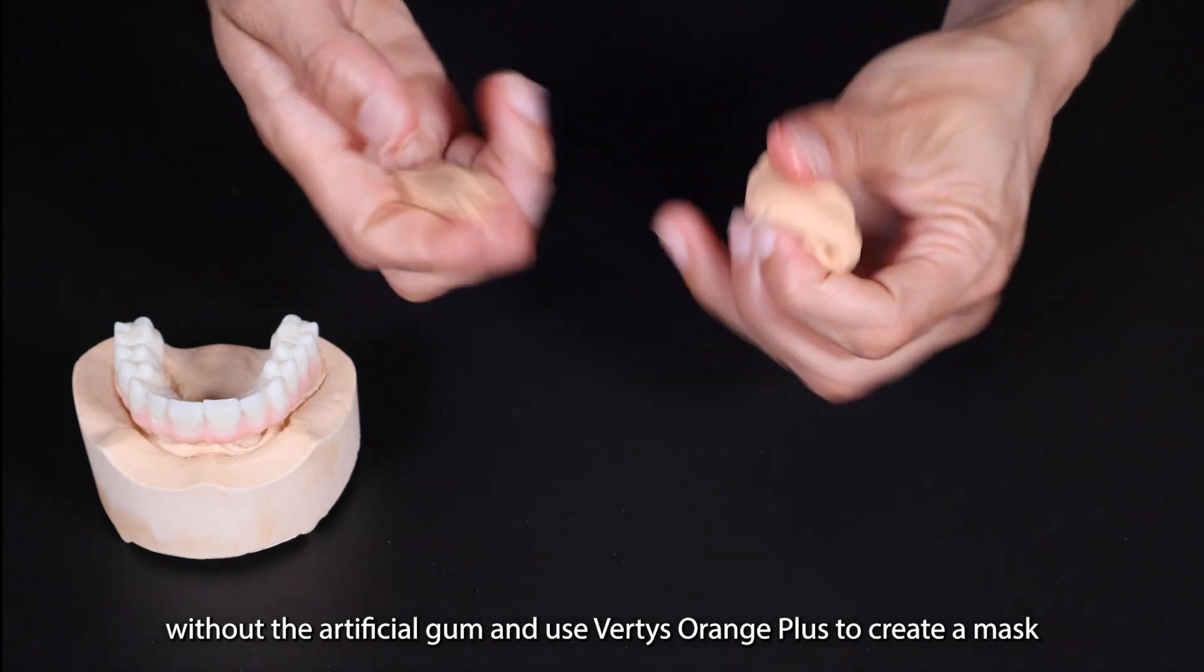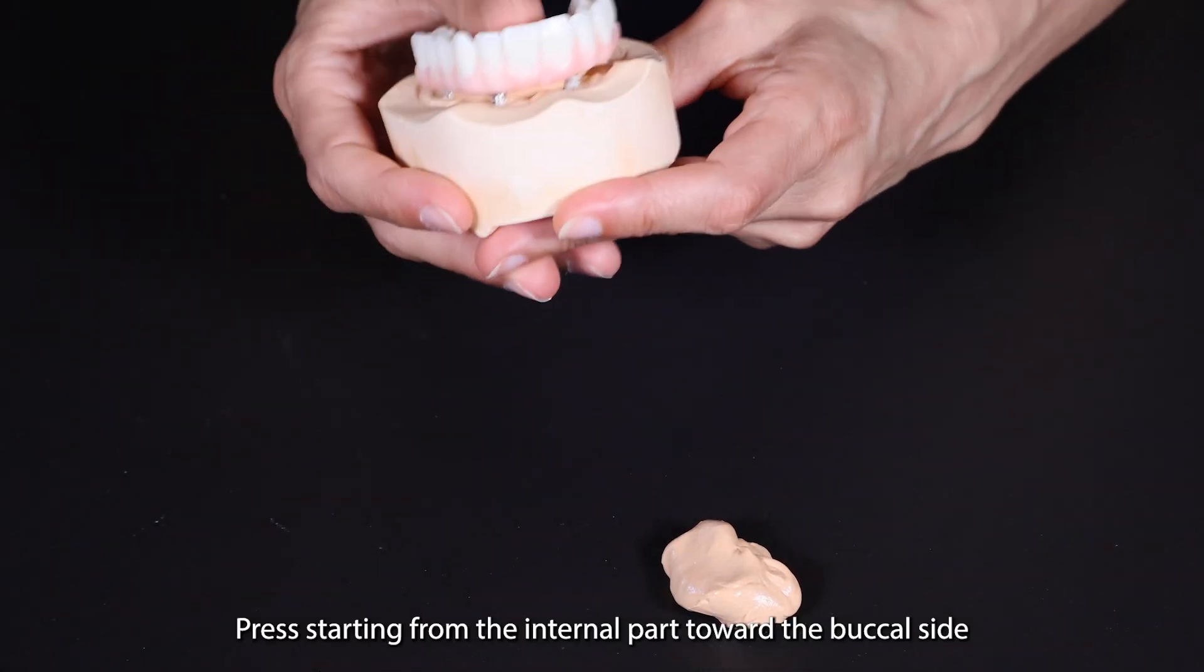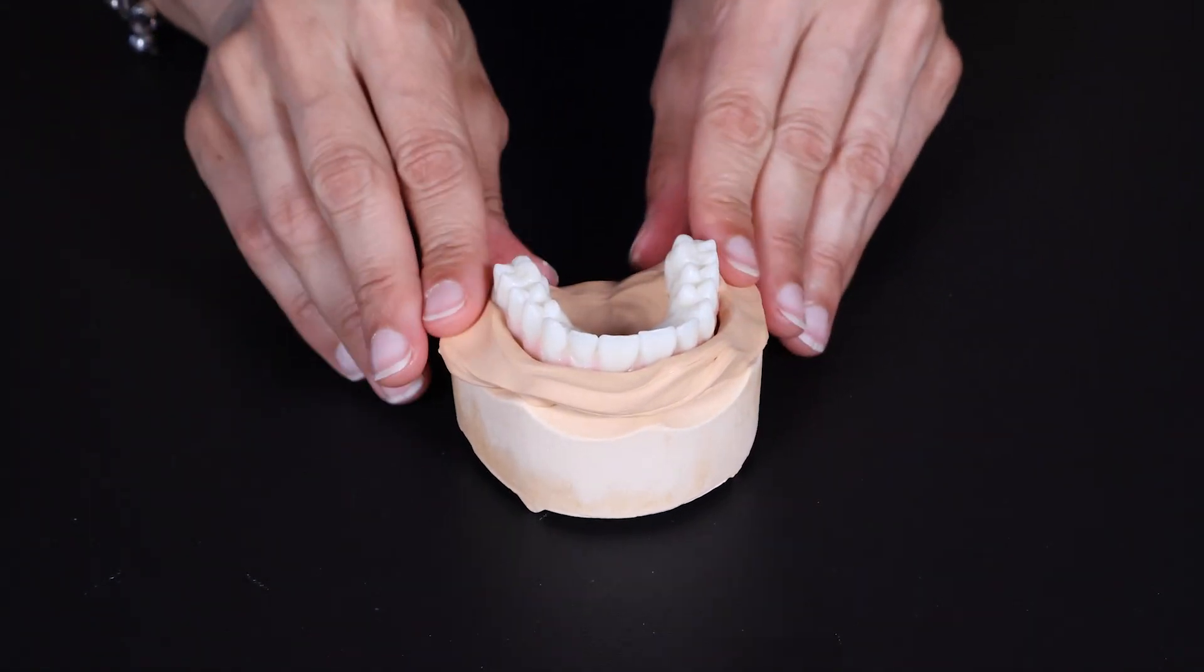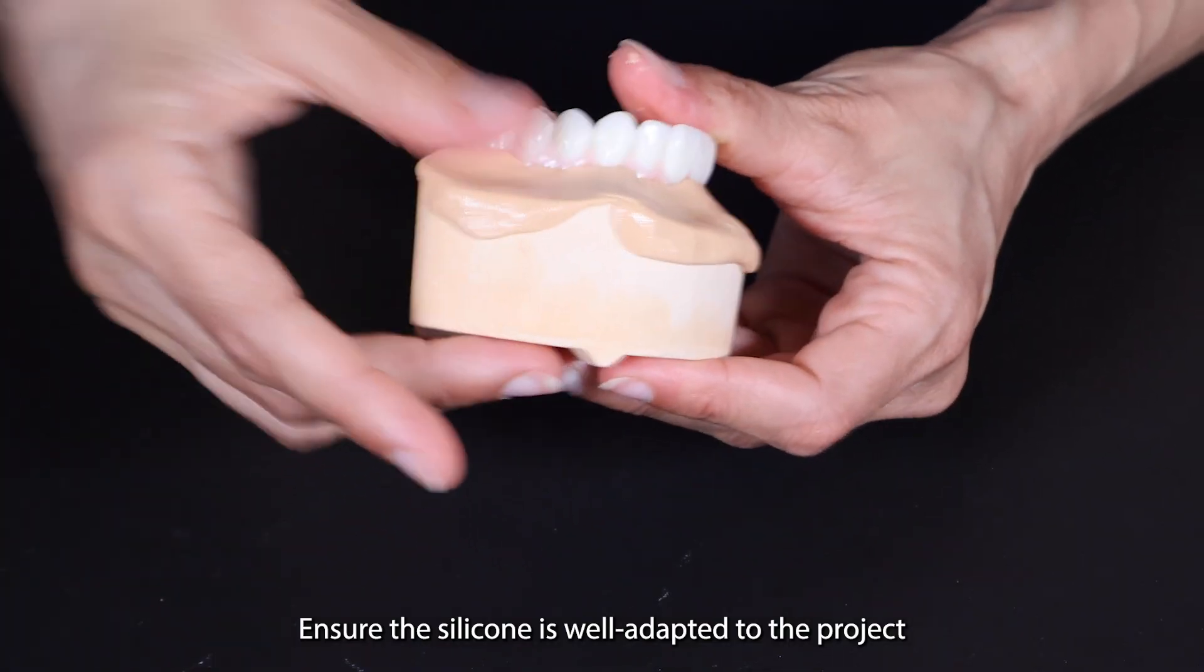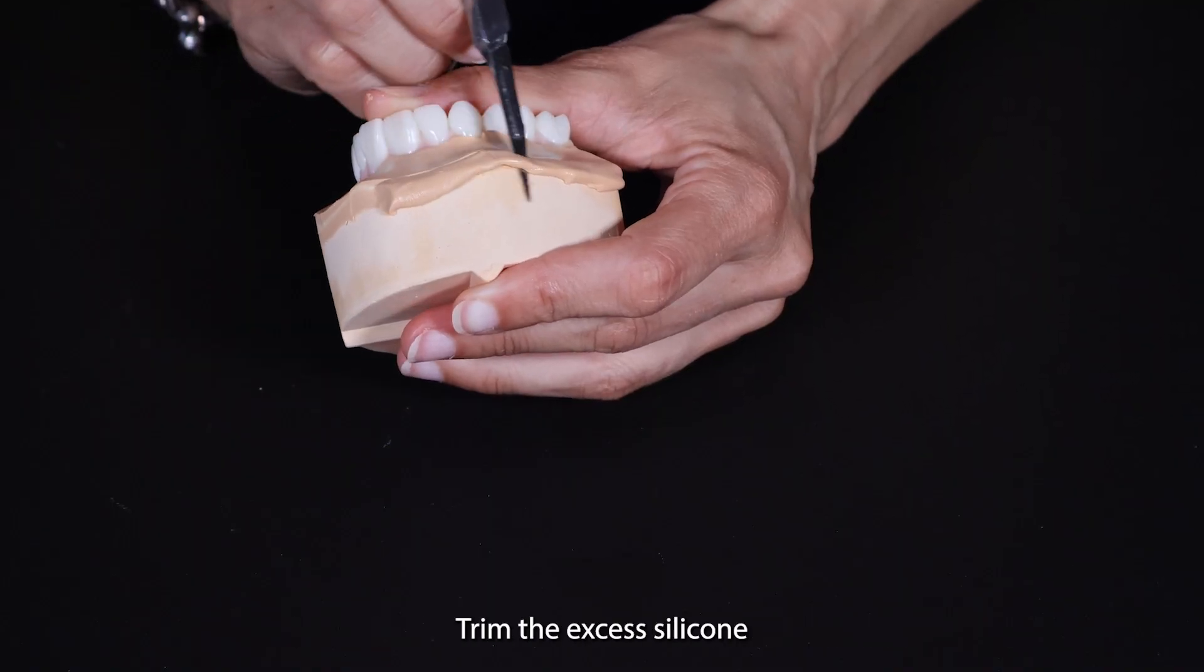Use Vertis Orange Plus to create a mask that will contour the entire project. Press starting from the internal part toward the buccal side. Ensure the silicone is well adapted to the project. It is important that the mask is smooth. At the end, trim the excess silicone.